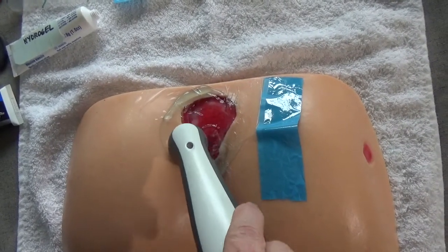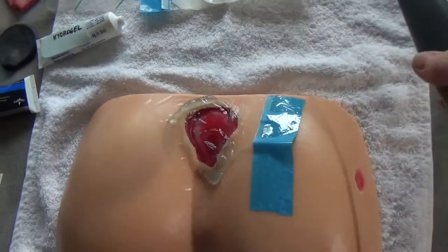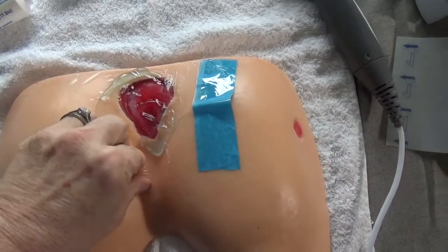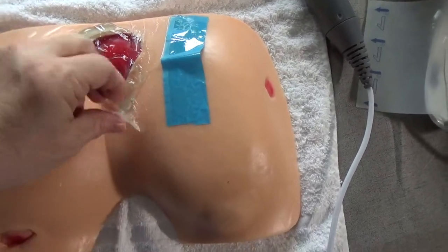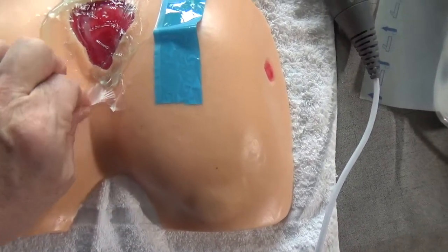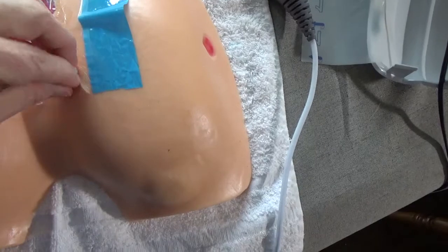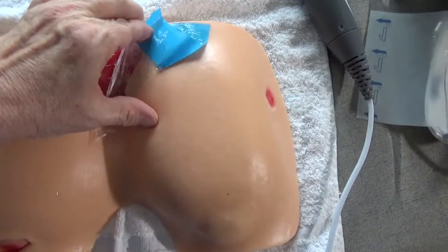After your timer is up, ding, you may lift the sound head, and then at this point you'll be removing the thin film that you have placed on there. To remove a thin film, you can do a lateral traction that makes it release some. You can do a move where you push down on the skin and pull up on the dressing.